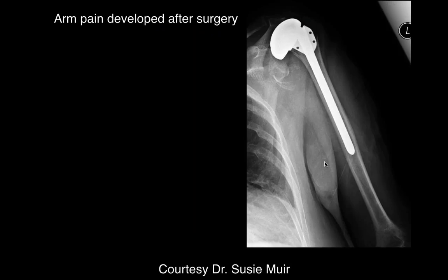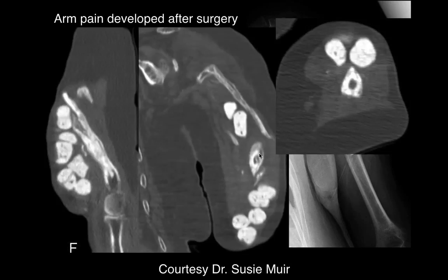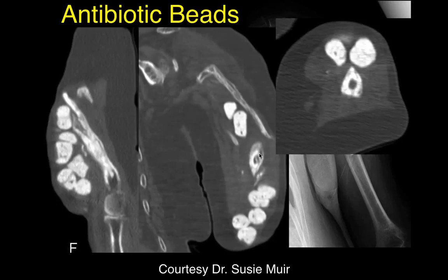In this patient who developed arm pain after total shoulder arthroplasty, the frontal radiograph shows the prosthesis with periprosthetic fractures. CT images show multiple hyperdense lesions — antibiotic beads. After removal of the implant and IV antibiotics, antibiotic-impregnated beads were placed, which slowly leach antibiotic over many weeks. This is another treatment option for prosthetic joint infections.